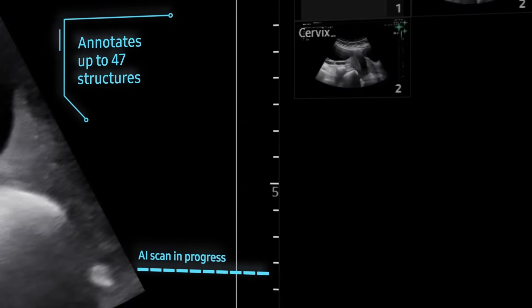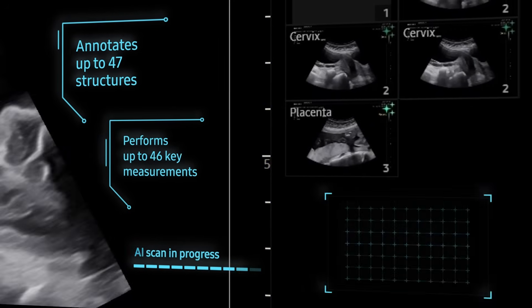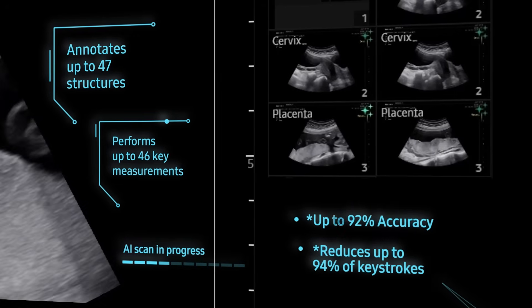Live View Assist automatically annotates up to 47 structures and performs up to 46 key measurements, ensuring 92% accuracy and reducing up to 94% of keystrokes.